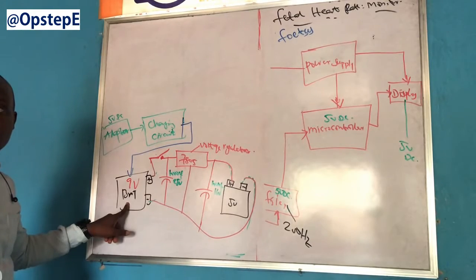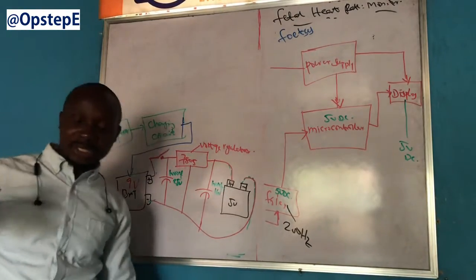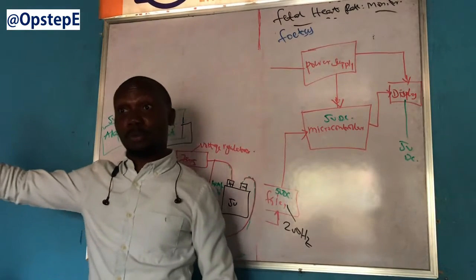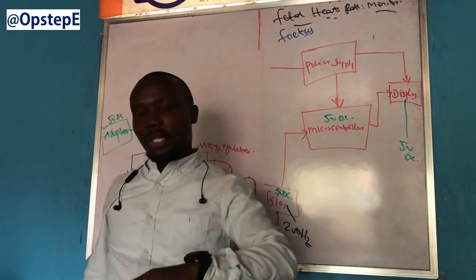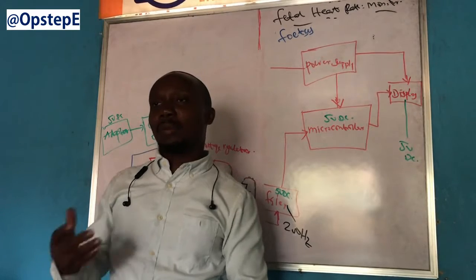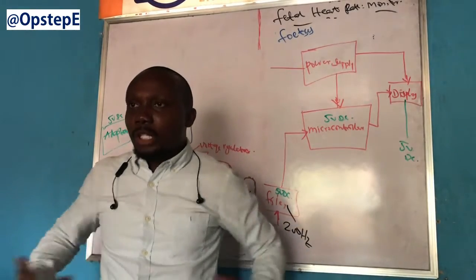The adapter must be 5 volts. Now, the adapter usually should be more than 5 volts, which was what was happening when you came and you met that previous project on Thursday. The output of the adapter is low. The output of the adapter is 5 volts. The battery there is above 5 volts. There is no way that adapter will have been able to charge that battery above its own rated voltage, because 5 volts in the adapter only gives 5 volts.